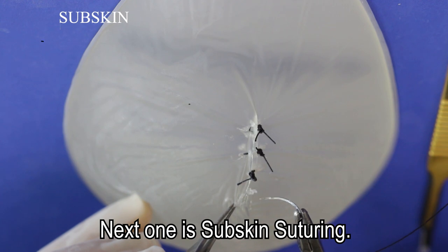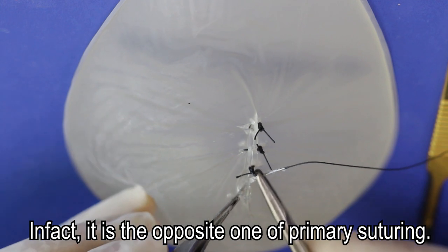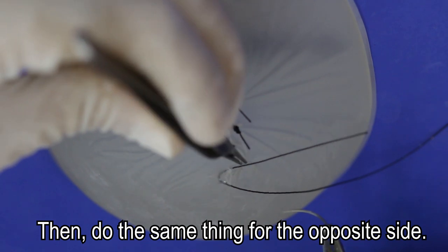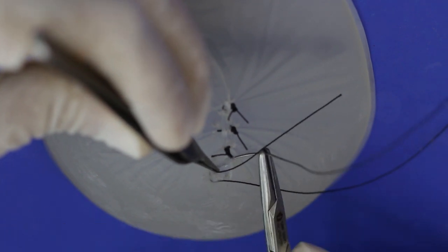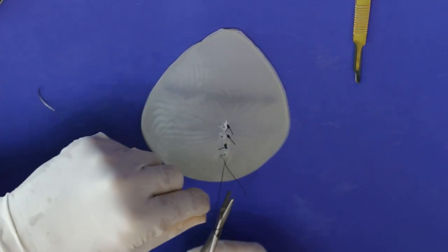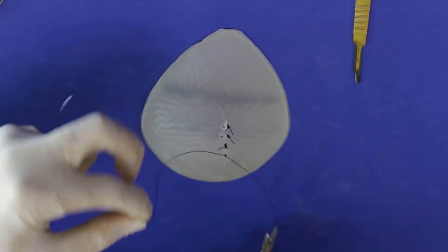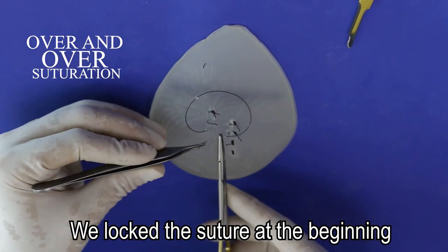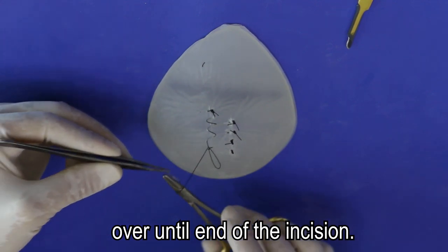Next one is subskin suturing. In fact, it is the opposite of primary suturing. Then do the same thing for the opposite side. Over and over suturing: we lock the suture at the beginning of the wound and then go over and over until the end of the incision.